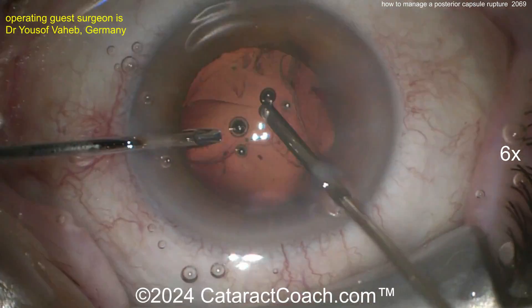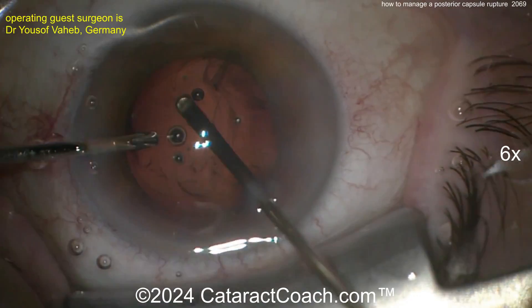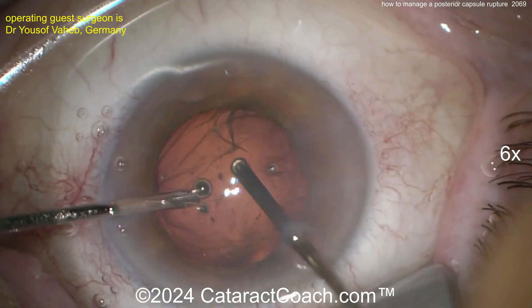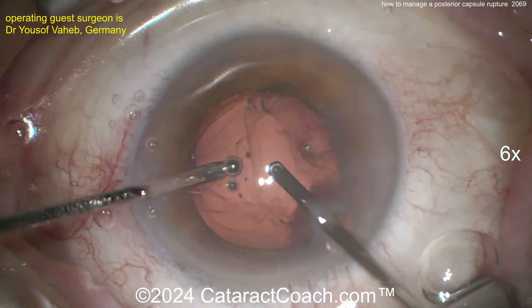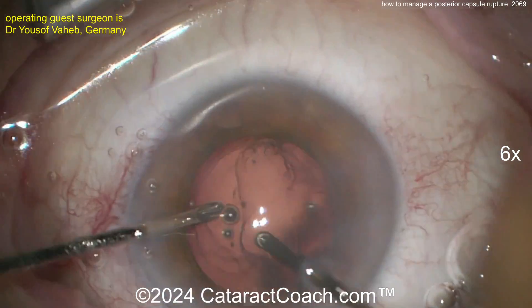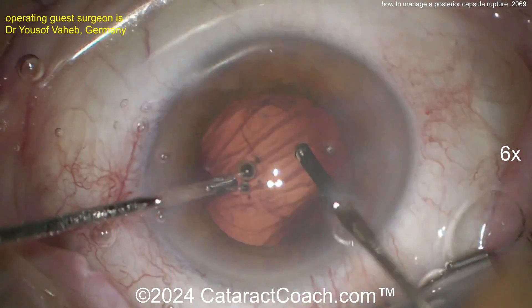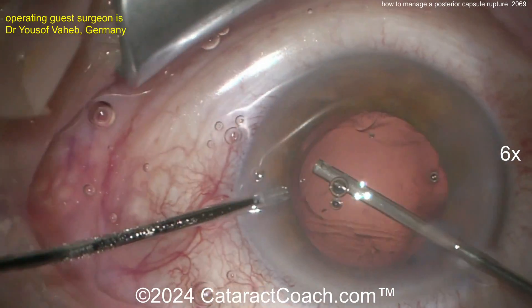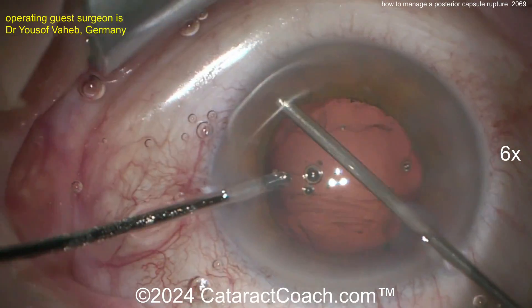Now what are you going to do for the vitreous? You've got to do an anterior vitrectomy. You can start without triamcinolone because you have viscoelastic, and you can already see some vitreous strands. However, at some point I still want to use triamcinolone to stain the vitreous — it'll help you do a more thorough job.